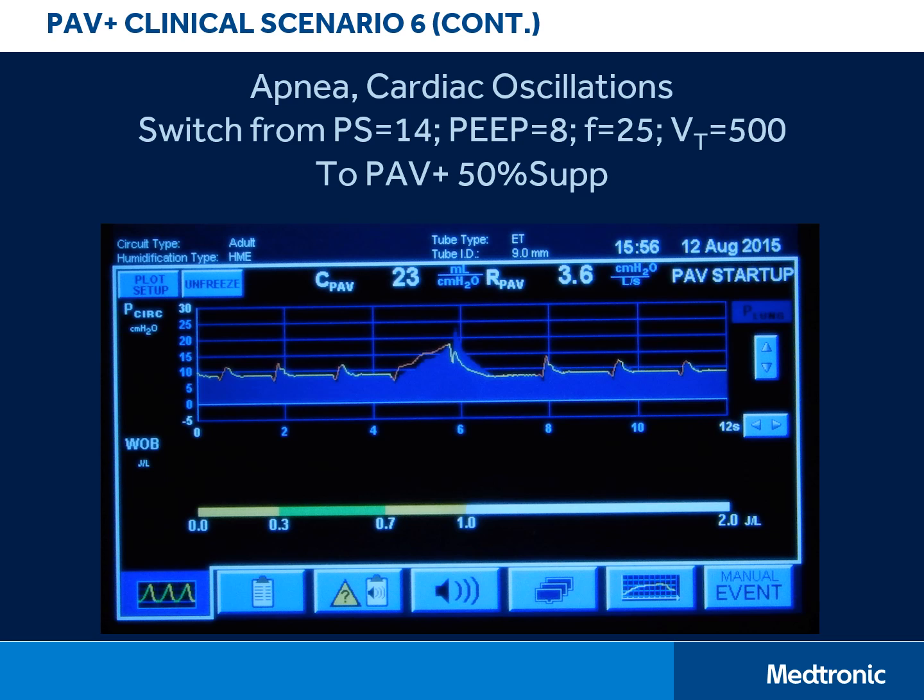Here you can see where we asked the patient to take a deep breath in, and they clearly were able to do so, but they still had no real drive to breathe after that single breath. A quick look at blood gases showed that the CO2 levels were on the low side and the patient was slightly alkalemic.